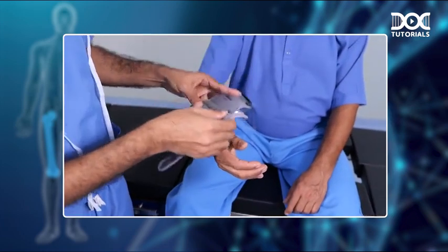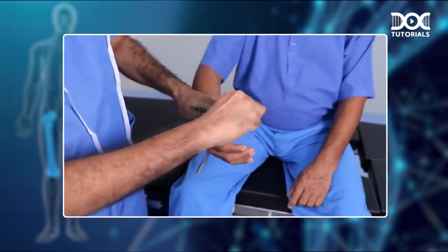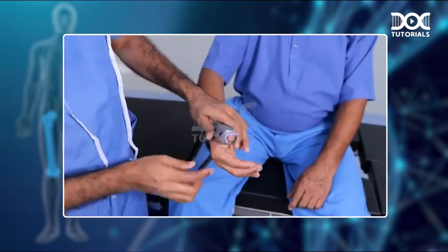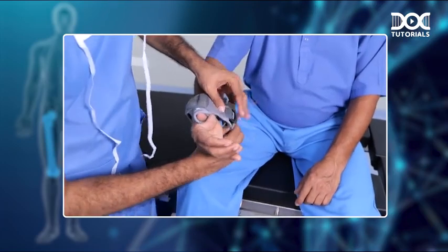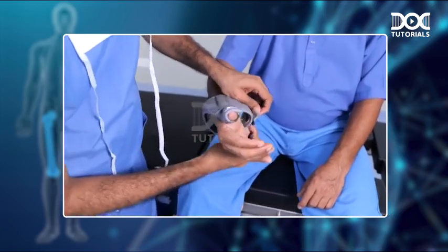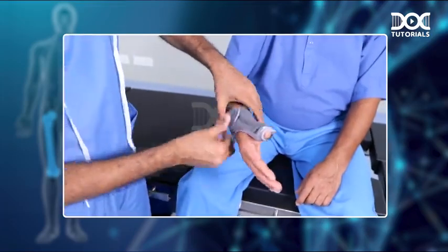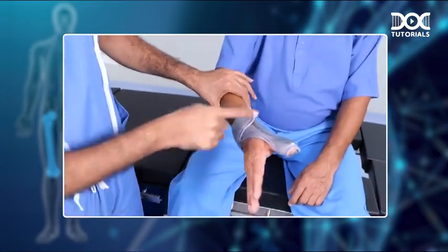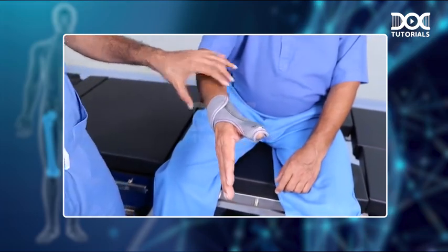The longish part should be on the radial aspect of the thumb, and you secure the thumb with the velcro straps first, then you wrap this part around the wrist and secure it around the wrist. How this will appear in the end. So you can see the longish part should come on the radial aspect of the thumb.